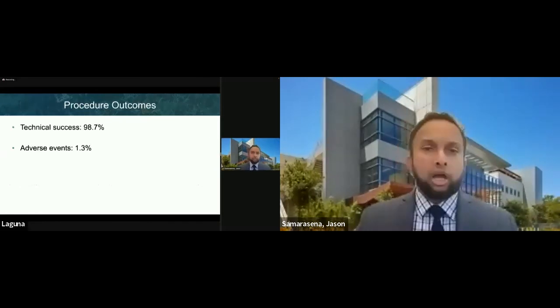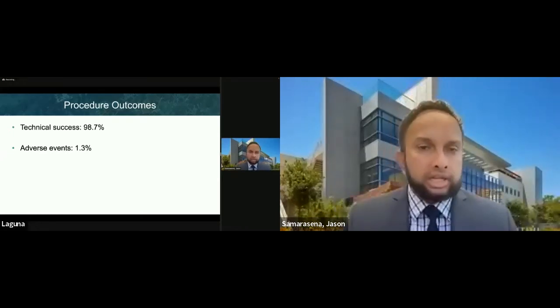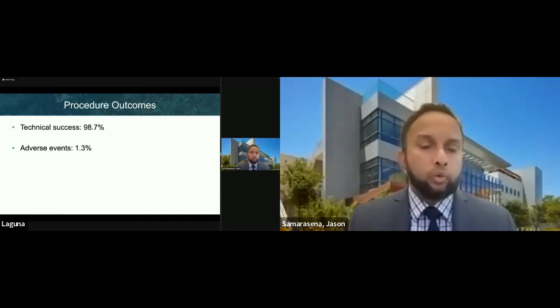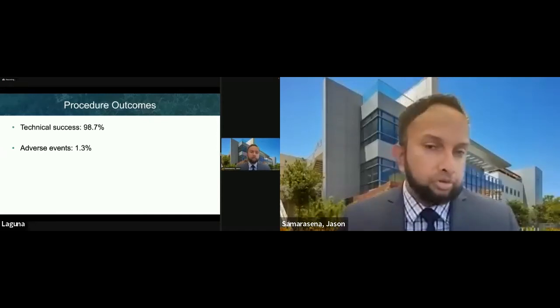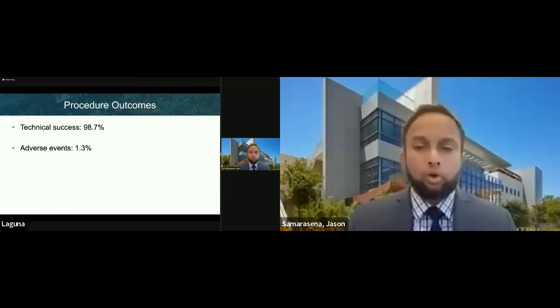With regards to procedural outcomes, there was technical success in over 90% of the 159 patients, and there were 2 episodes of bleeding that were self-limited. The patient was hospitalized, and there was no transfusion or extended hospitalization needed.